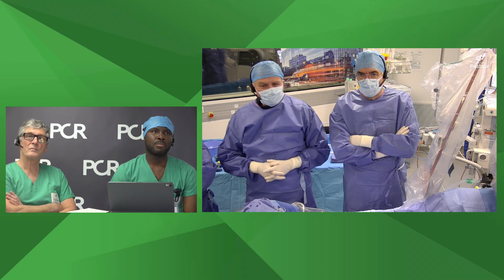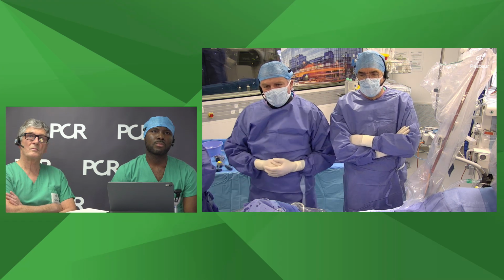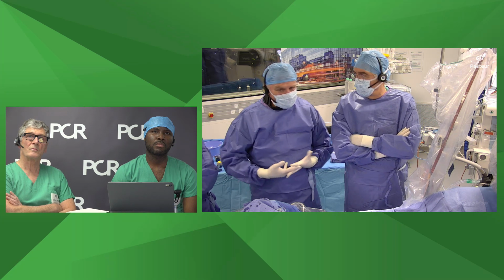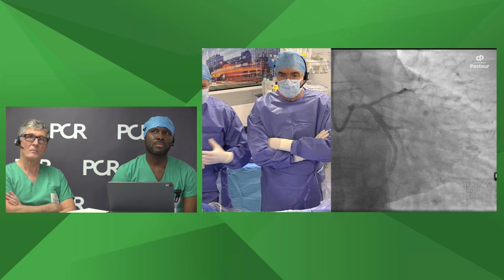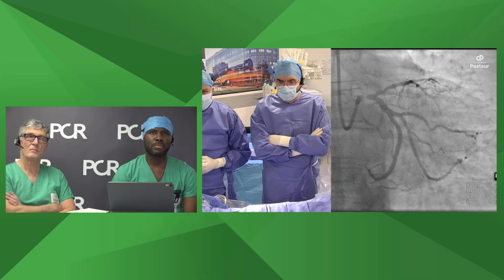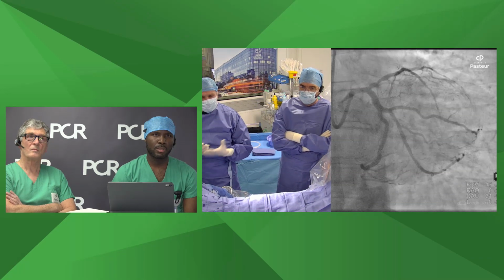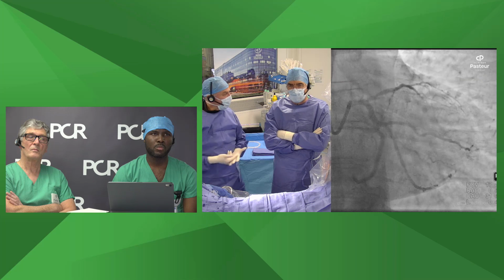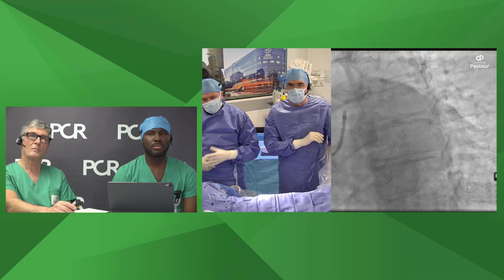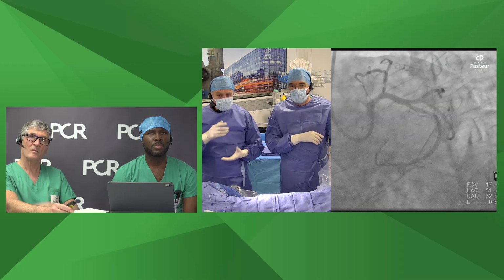So the strategy, I think, is that we will treat left main LAD first: pre-dilatation, then the stent, and there will be a discussion of the size of the stent because we have to be in accordance with this large circumflex. What diameter should we achieve at the level of the left main? It will be a discussion of the diameter of the stent we want to take to achieve this large diameter in the left main. Then the second step will be the POT.